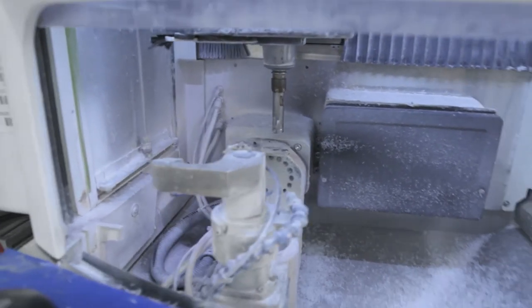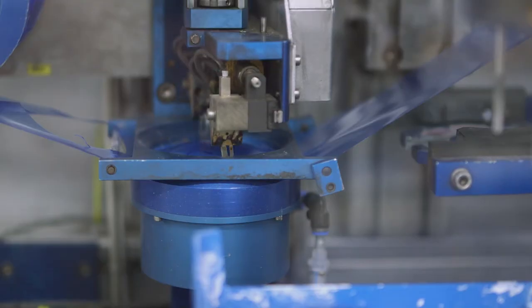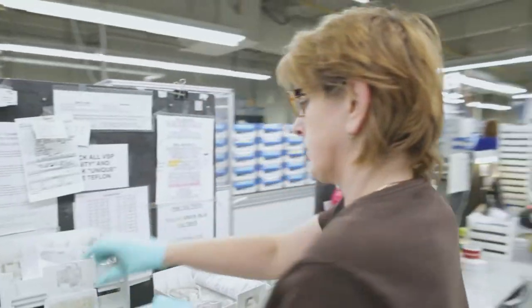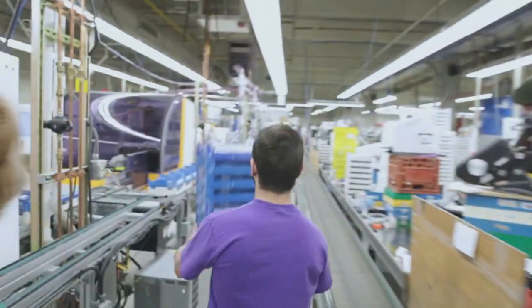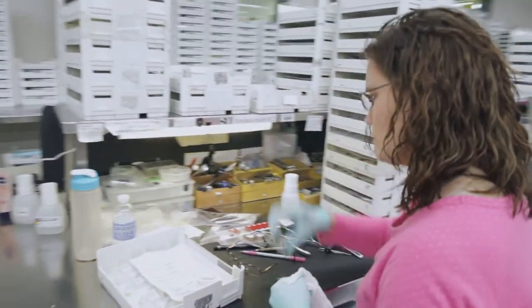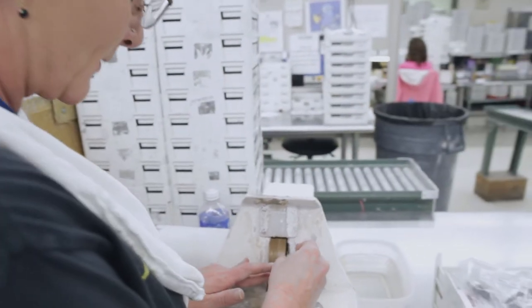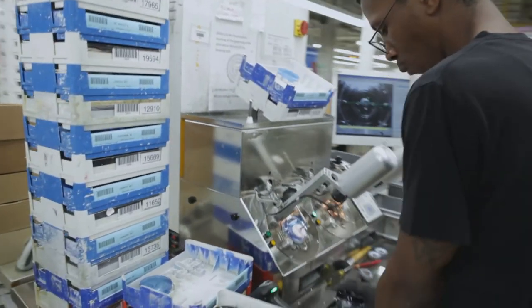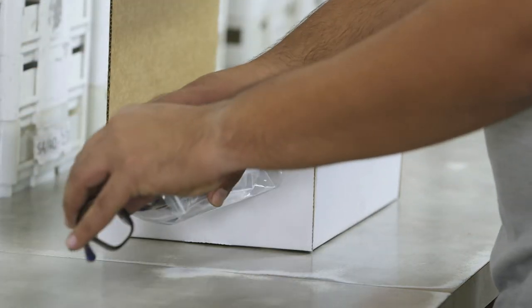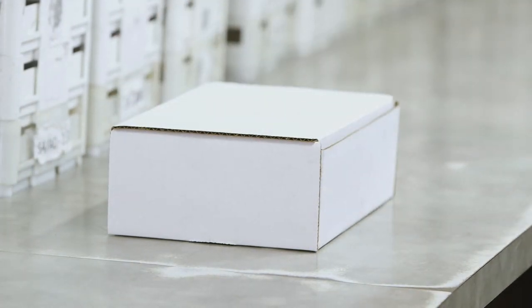This machine can cut literally any shape imaginable. At Midland Optical, we pride ourselves on our use of technology, but we pride ourselves even more on our experienced workforce. Delivering the highest quality lenses, providing second-to-none quality control procedures, and a meticulous inspection process is only possible through our greatest asset: our family of employees. Now you've seen for yourself how, with cutting-edge technology and an experienced and dedicated workforce, Midland Optical does more.